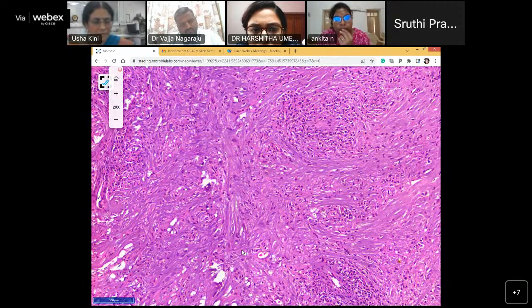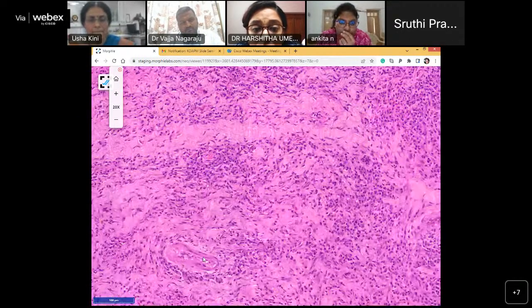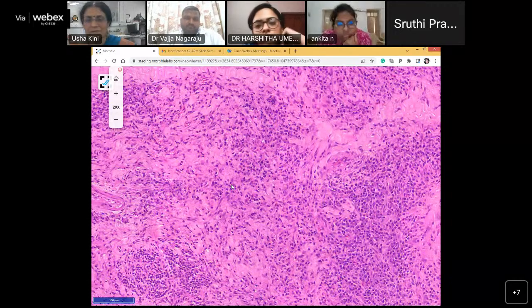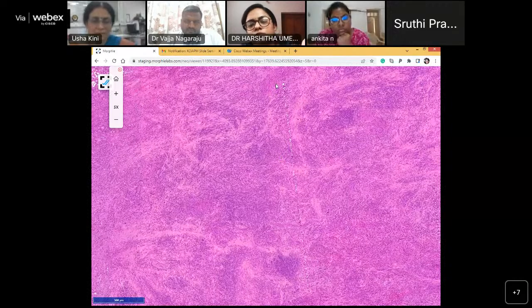Okay, what about this blood vessel, Ankita? Yeah, that looks normal, right? Yes, ma'am. So there is a pause, some blood vessel there, let me look what has happened. I'll tell you why we are not able to see the blood vessels so well. They are collapsed because of this material.